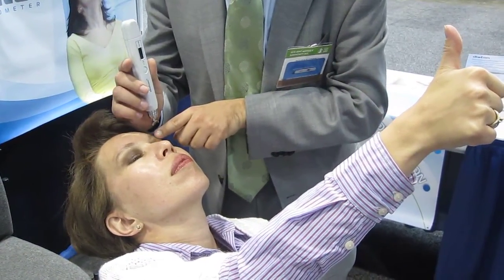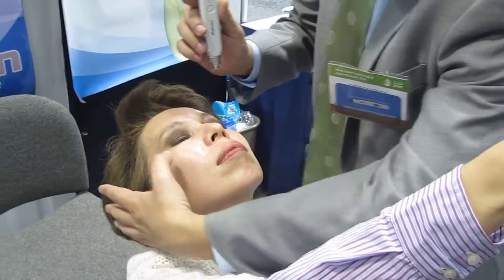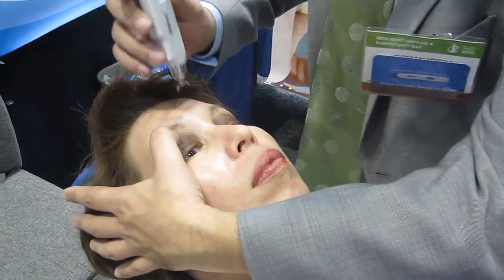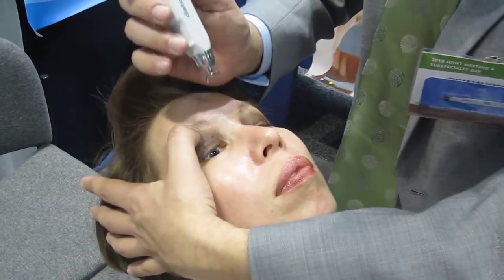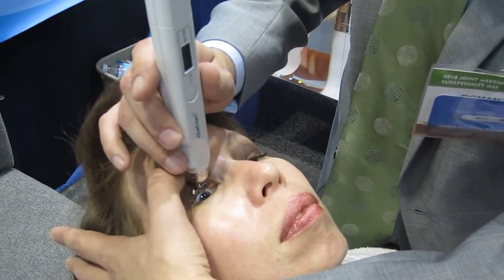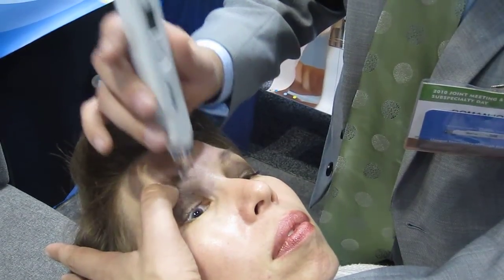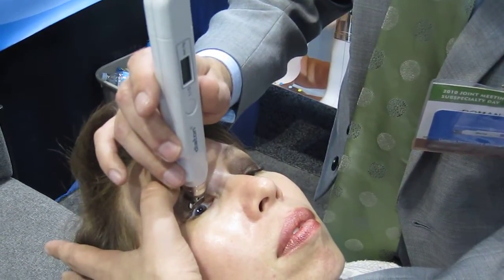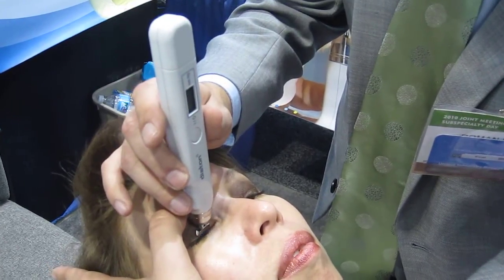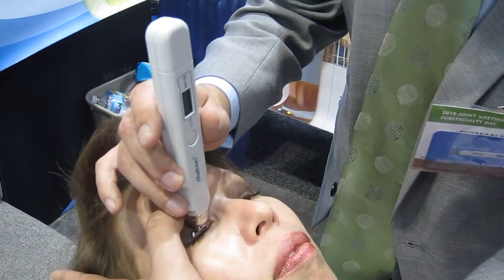Get the tonometer into working condition. Use the index finger to pull on the eyelid, then go around the patient's face and use the thumb, gently pulling it upwards. Use the edge of your palm for support. Place the tip of the tonometer right over the tarsus, make sure it's in a vertical position, and make sure it's not sliding onto the cornea. The reading should be done over the sclera, not the cornea.